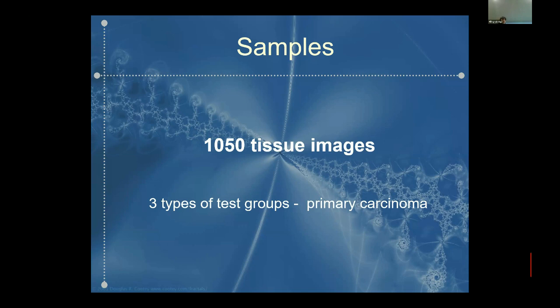There are some theories that pathologists do not want outsourcing or open access, to keep, I don't know, maybe their diagnoses safe. But it is a big problem because there are no open databases on the internet, especially of microscopic images. Nowadays, especially after COVID, there are some good databases, but one always questions whether they were taken under the same uniform conditions, in the same hospitals and with the same scanner or MR.